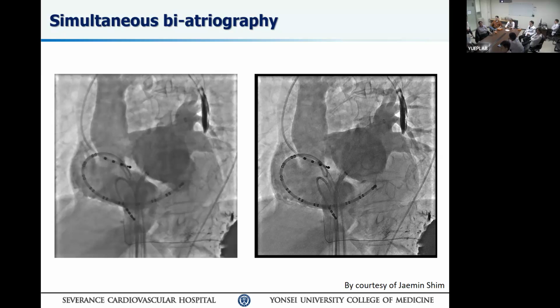If you do multiple transeptals, it gets difficult each time because it gets thicker from scarring from your previous transeptal. Just be aware of that. So next time you have to push a little harder to go through. But with confidence, you don't worry about whether you're going to make a hole or not. You're determined to get it done. Push up, engage the dilator first, very carefully, and then push through quickly. Then you're going to pierce through.